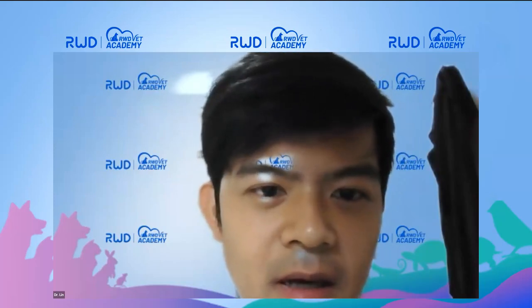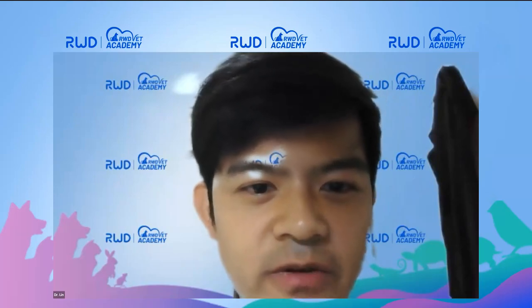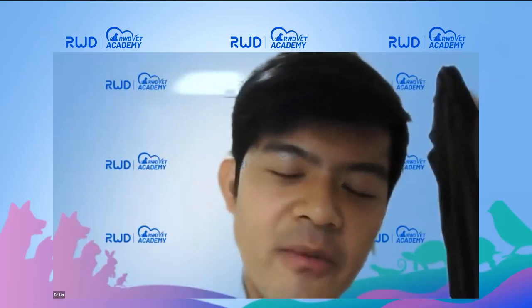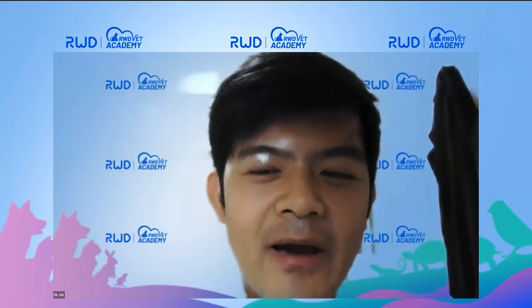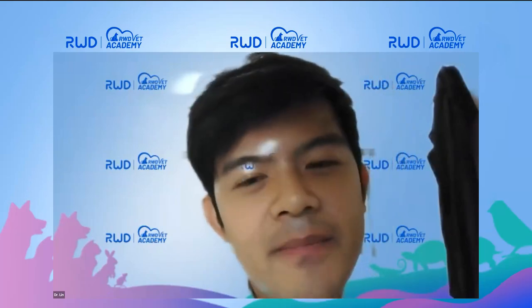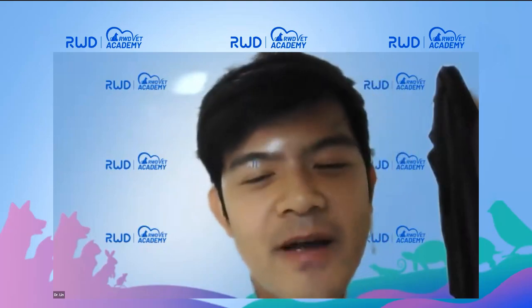The next one is, how many times should we do acupuncture therapy? In your case, you use once a week. What if we do it 3 times a week or more? In my opinion, the laser therapy will promote self-repair. So once we do the laser therapy, we need to give the body more time to repair itself. If you do laser every day, the body will not have enough time to repair itself. So I always recommend doing laser therapy about 2 or 3 times per week. But if the owner is very busy, at least I suggest once a week. It's okay.